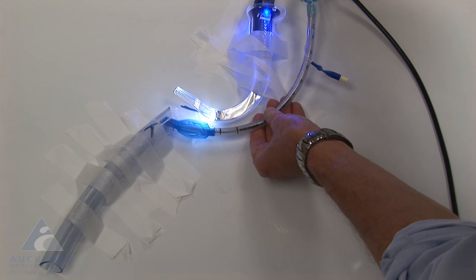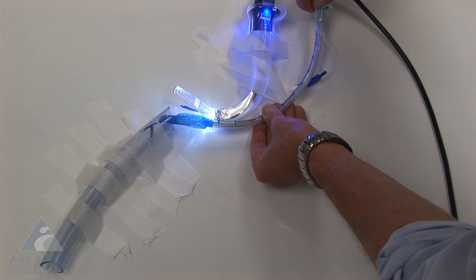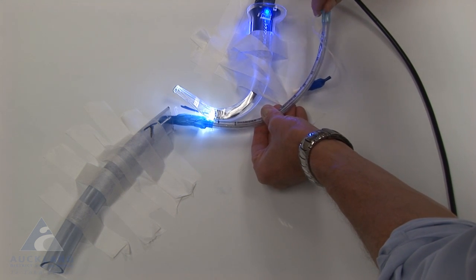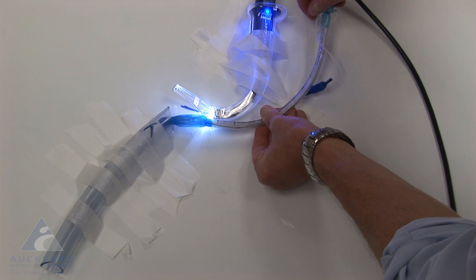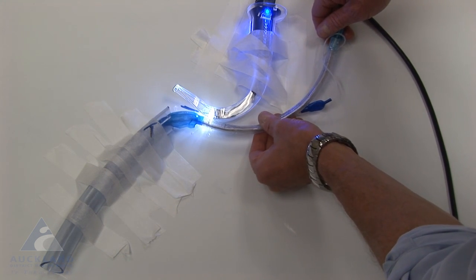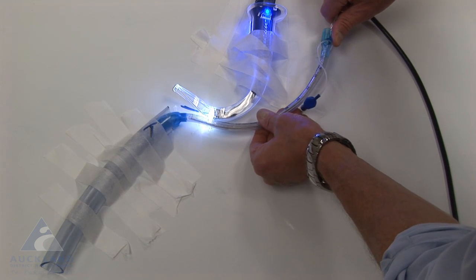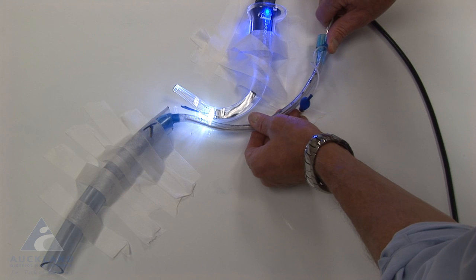I pull the stylet back, and I've pulled it back a couple of centimeters here, and then we're actually going to spin the endotracheal tube on the stylet, and you'll start to see it spin, and you can see how it's broken the friction on the anterior tracheal wall, and it's going to advance down off the end of the stylet and down into the trachea.